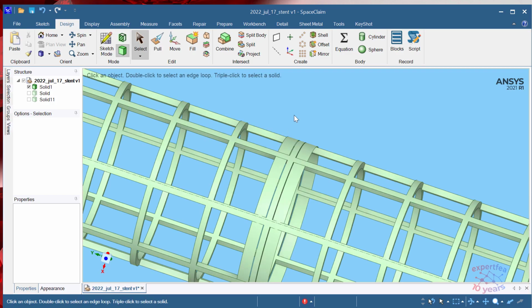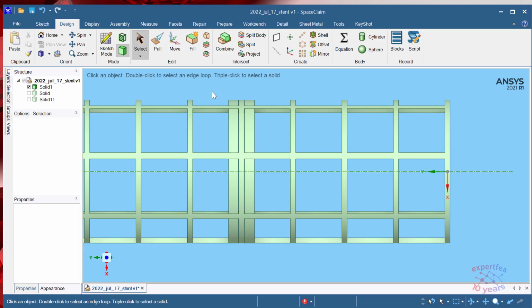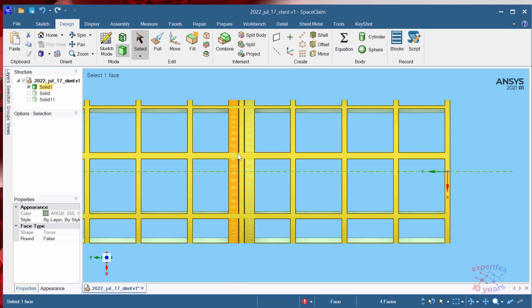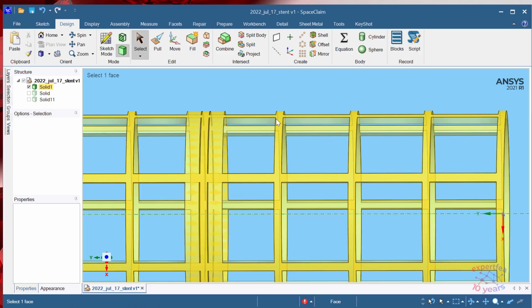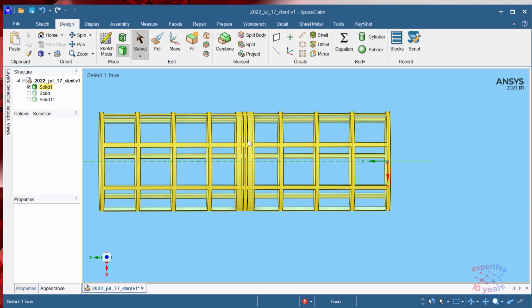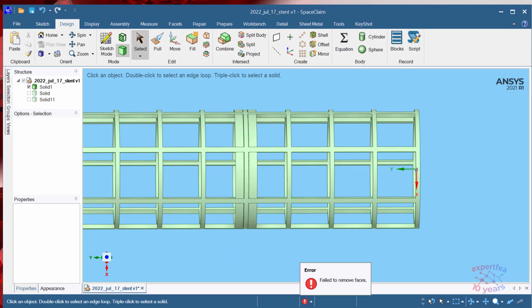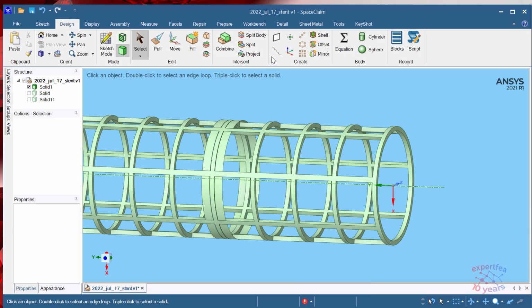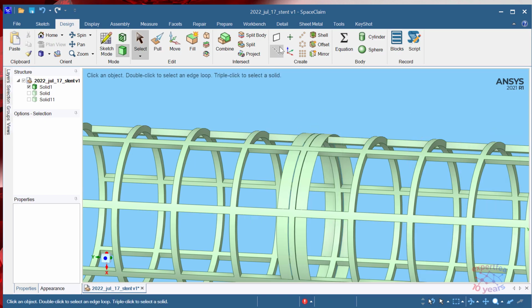Yeah, alright, let's separate them. Alright, let's delete all of this. Why should it work? Well, it's possible also not to work. Let's at least make this plane. Let's materialize this plane.